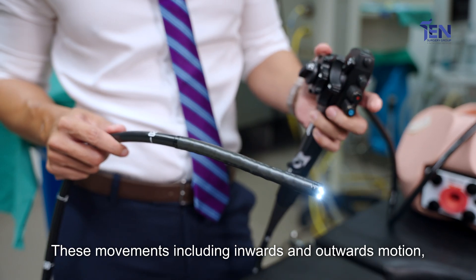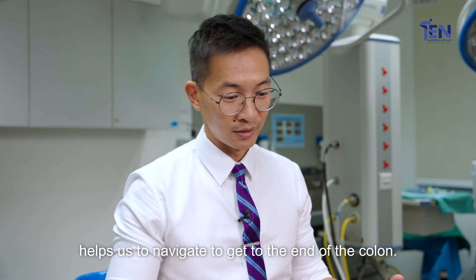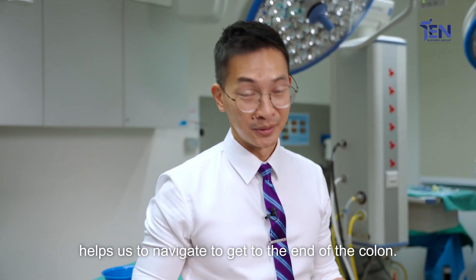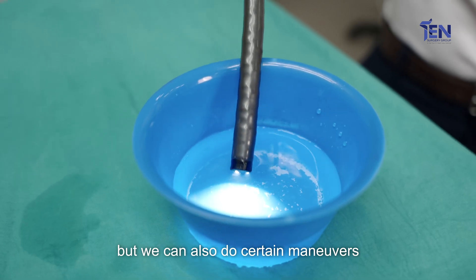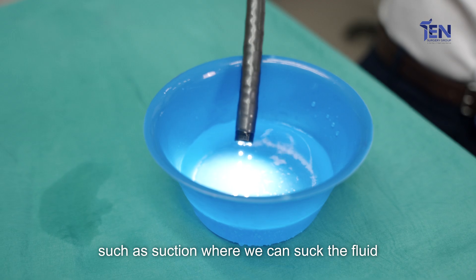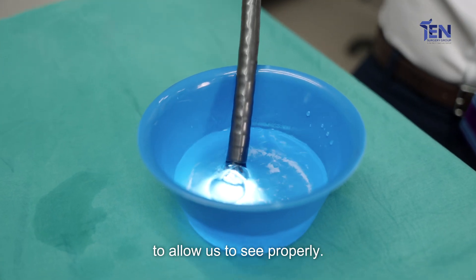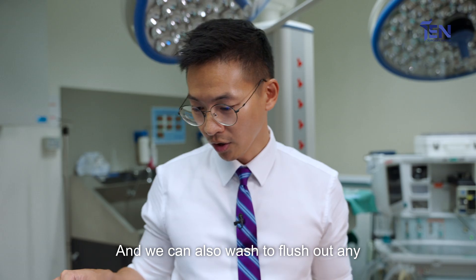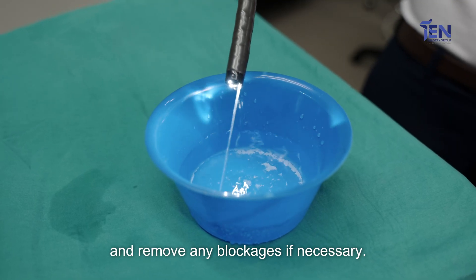These movements, including an in and outward motion as well as a rotational motion, help us to navigate to get to the end of the colon. Not only can we move the scope but we can also do certain maneuvers such as suction, where we can suck the fluid, or we can blow air to increase the size of the colon to allow us to see properly. We can also wash to flush out any dirt or impurities from the colon and remove any blockages if necessary.